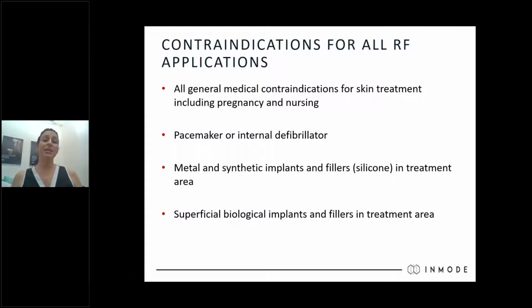As I said before, and I will say it again today, contraindications, and I will not read you through the contraindications, okay? All contraindications should be read by therapists. If you're a therapist, I don't know exactly who is with us today, okay? If you're a trainer or a therapist or an end user of some sort, a doctor, whatever you are, it is super important that you read through the contraindications. You know that they exist, and you make sure that your doctor is aware of it and your patient is aware of it. The patient should be signing an informed consent form prior to the treatment, saying that they're not suffering from any of the contraindications, and that's where you can start the treatment, okay?